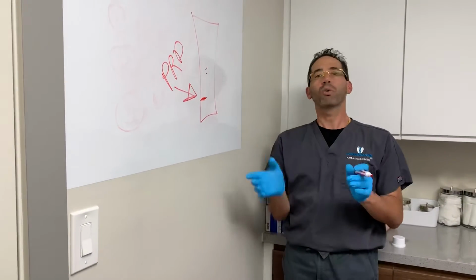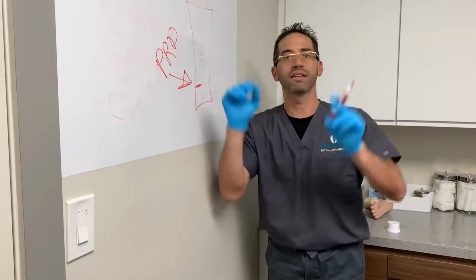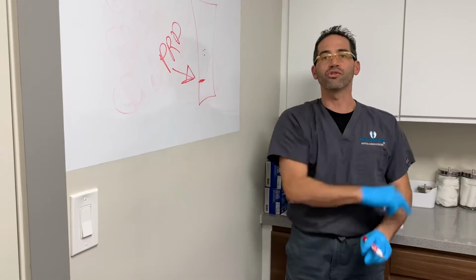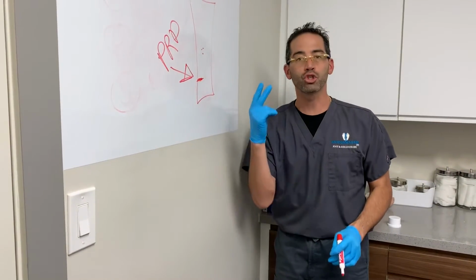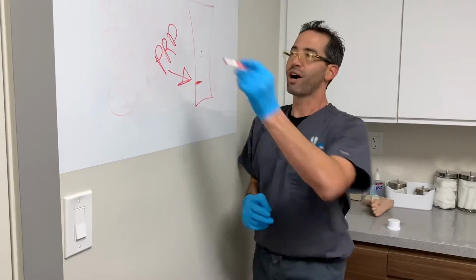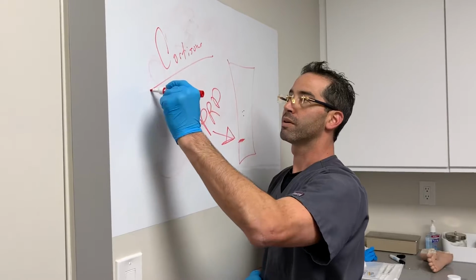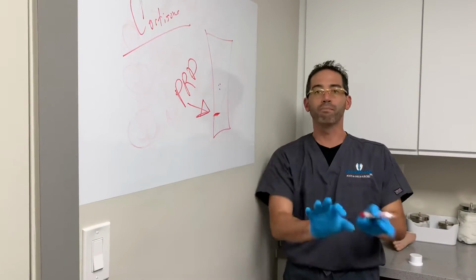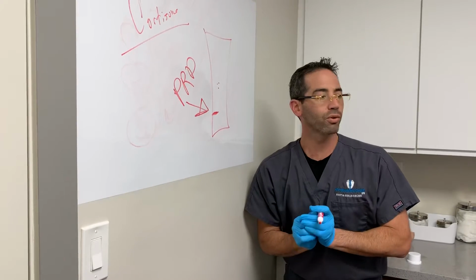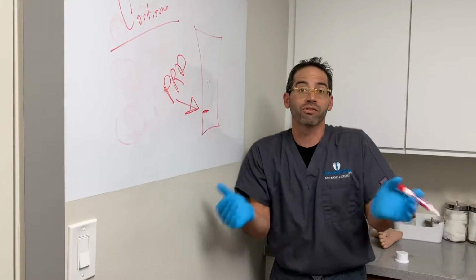But the patient doesn't want to look back, right? So she's here today because she wants to try, even after 2 years in the chronic stage, these 2 injections of cortisone. Okay. A little steroid injection into both. Very, very little. We're not going to go all bunkers here, right? Just a small amount to see what happens, right?